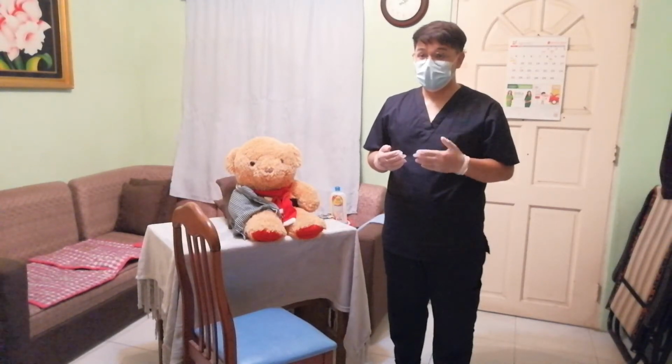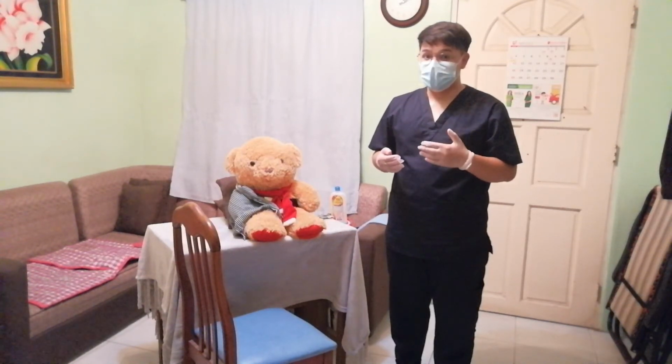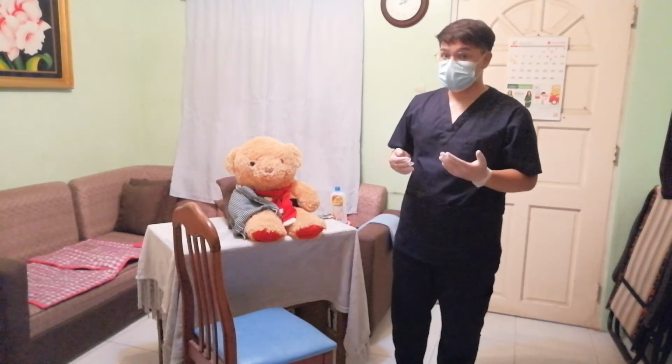And after that, we will need to continue bracing the patient's knees with our knees, and we need to hold the gait belt. And after that, we need to flex our knees and our hips to help the patient to sit in a chair.